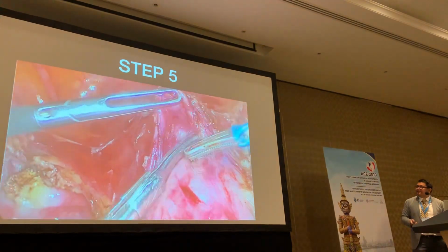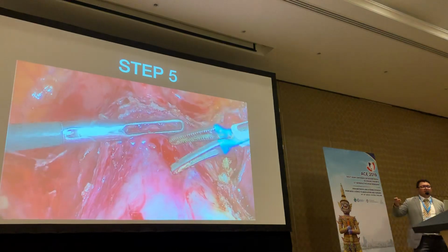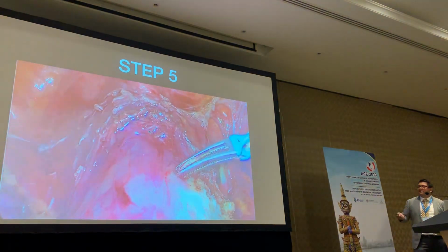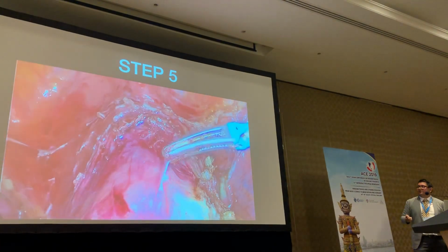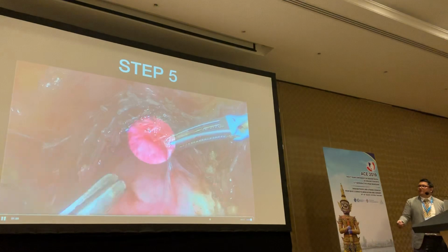And I do quite a bit of dissection down, so even when I close, I have a good vaginal cuff to close. I will open the vagina somewhere here, but I still have a good cuff to close with.